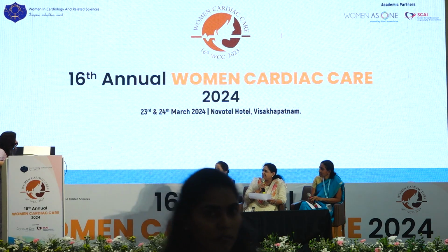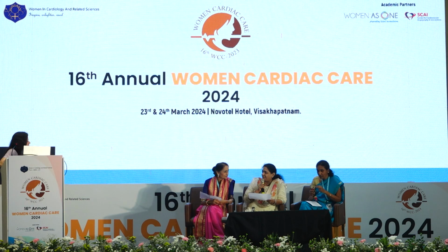Ma'am, BMS is not so much available on our shelf. Okay, so that is a practical problem. We had contemplated putting in a BMS, but we didn't get the right size, and eventually we settled for what is available. Okay. Have you gone through the article by Dr. George Joseph, a state-of-the-art review in Takayasu arteritis, published by the American Heart Association?